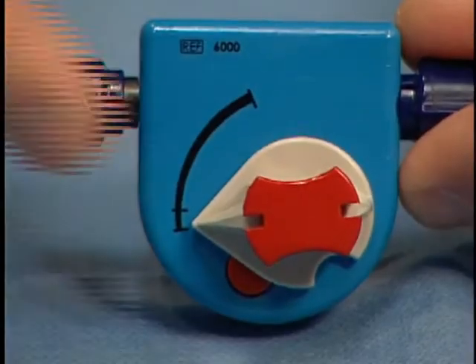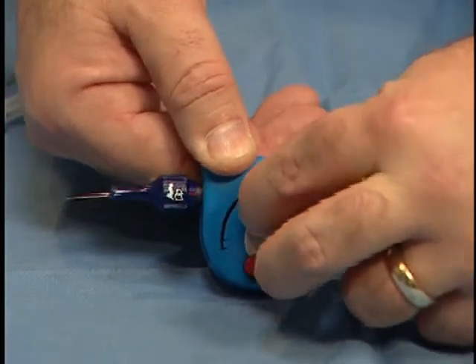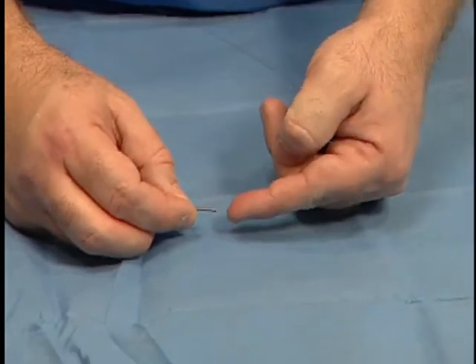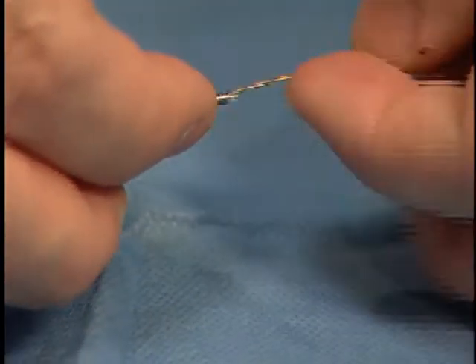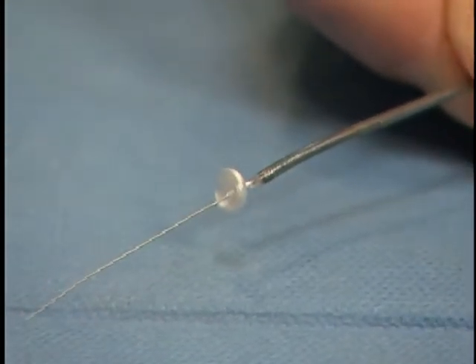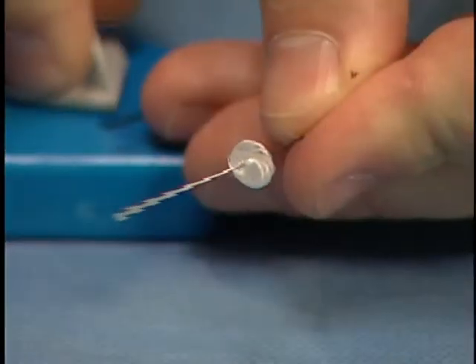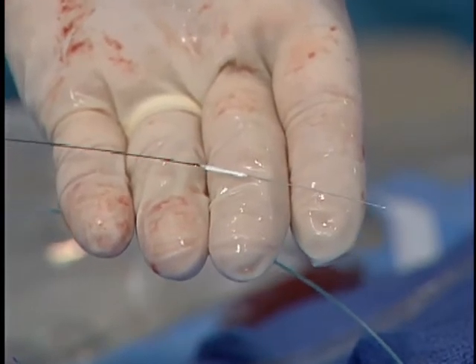The wire is loaded in until it's seen coming out of the back window, then I close these down and remove the locking device. You simply rotate the knob until the red button clicks into place, and as I rotate this knob, the filter is going to pop open. This is the retrieval catheter — the aspiration catheter — with an introducer sleeve. The wire goes into the introducer sleeve, and as you push this in, the introducer sleeve comes out the back at the monorail sleeve, with the aspiration catheter right up against the fully deployed filter. To retrieve it, you simply push in the red button and rotate the knob back, and the filter will collapse back into the device.